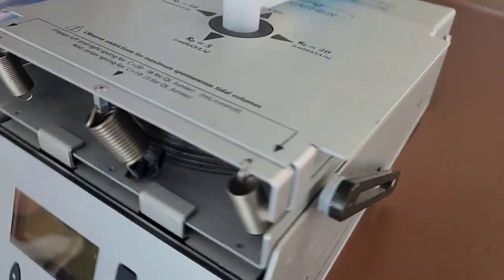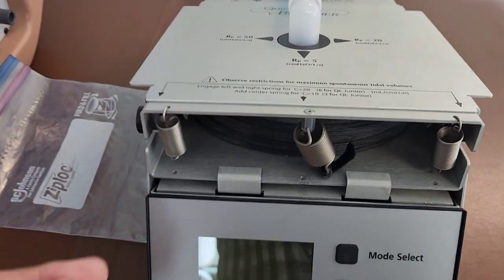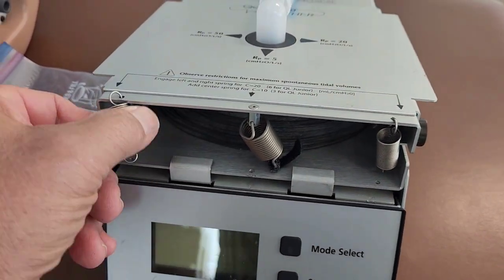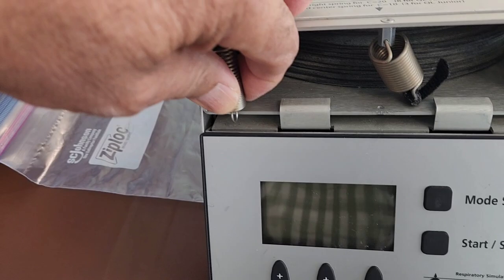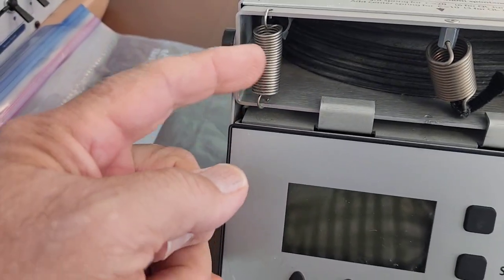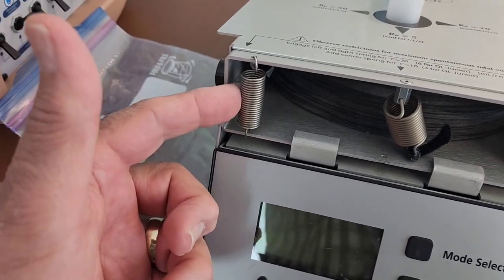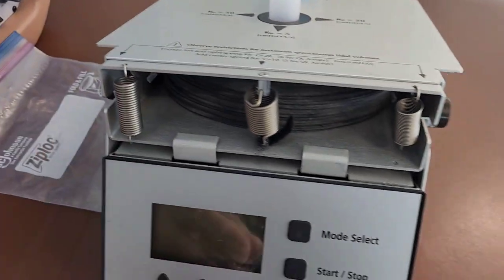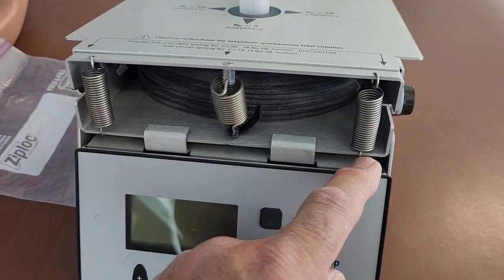Well, the other lung simulator that we have is the Ingmar Medical Quick Lung Breather. This is designed to create decreased compliance, and the way we do that is that we hook these rings, these springs, underneath. Let's see if we can do that. Under the plate here, like that. Okay, and then that would be some decreased compliance, allowing this lung to not expand well, creating a stiff lung. And then we can also add another spring on this side.